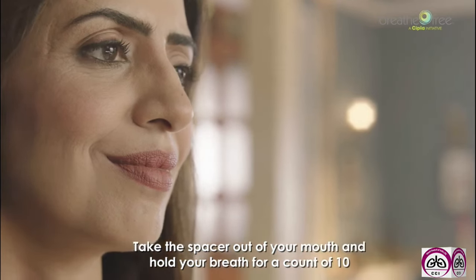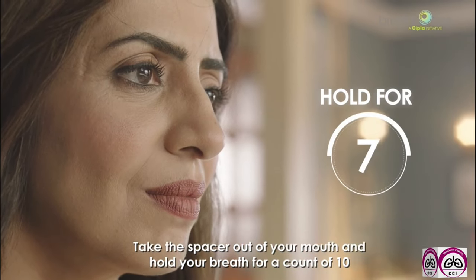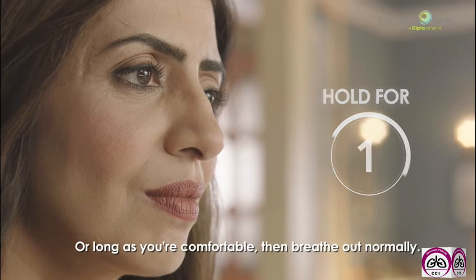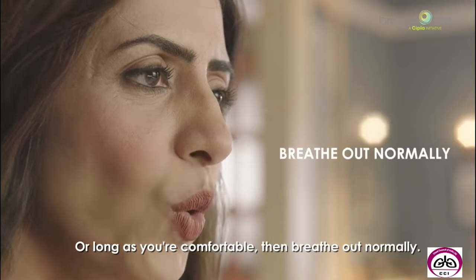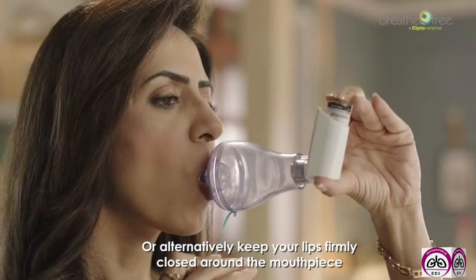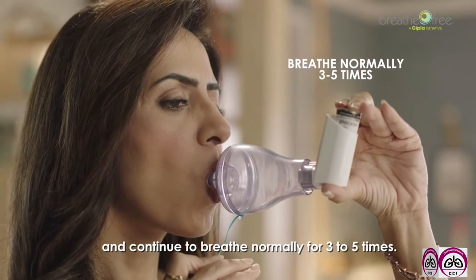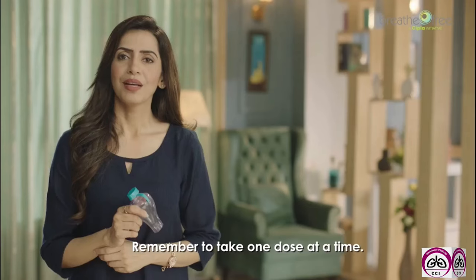Take the spacer out of your mouth and hold your breath for a count of 10 or as long as you're comfortable. Then breathe out normally. Or alternatively, keep your lips firmly closed around the mouthpiece and continue to breathe normally 3 to 5 times.